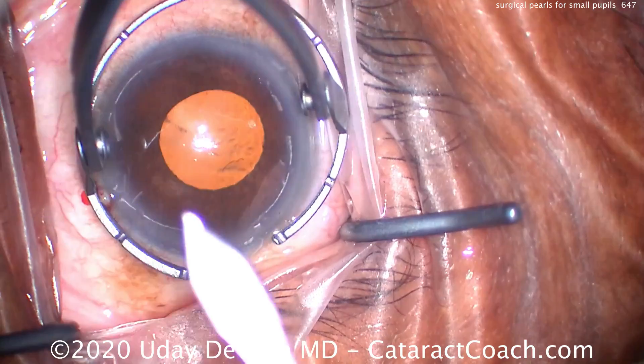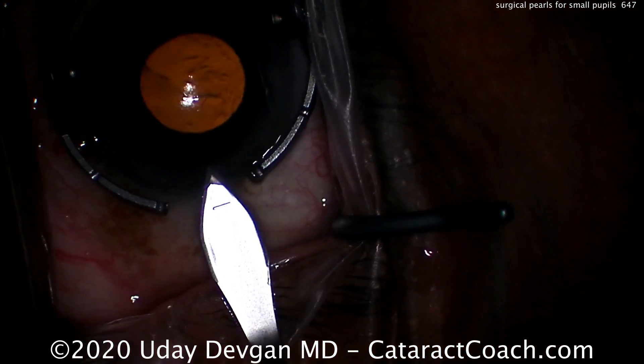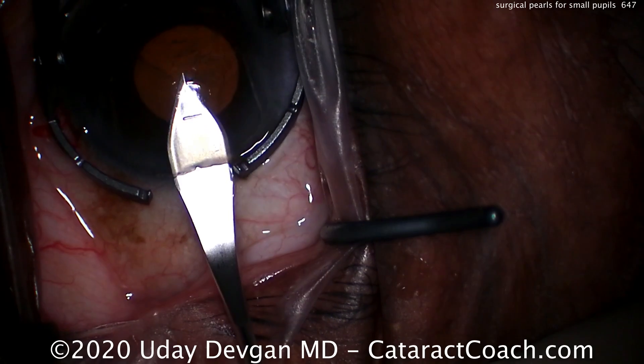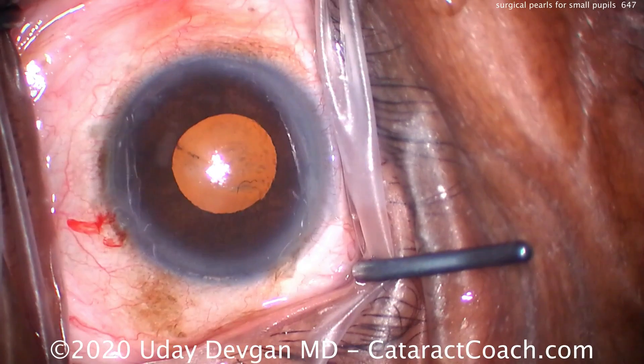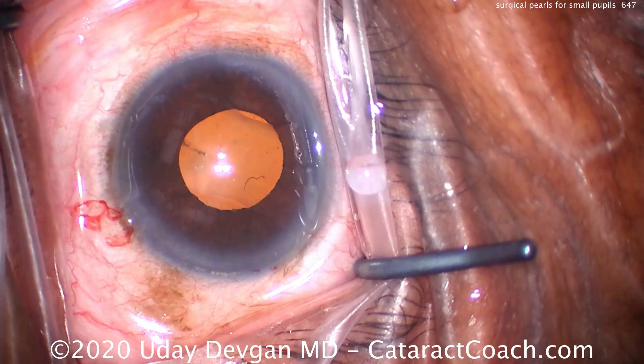Making the main incision here, we're going to make this incision in a very appropriate position so that we don't end up having iris prolapse. Because this patient, like many of the small pupil ones, takes Tamsulosin or Flomax and can be a good case of IFIS, or floppy iris syndrome.